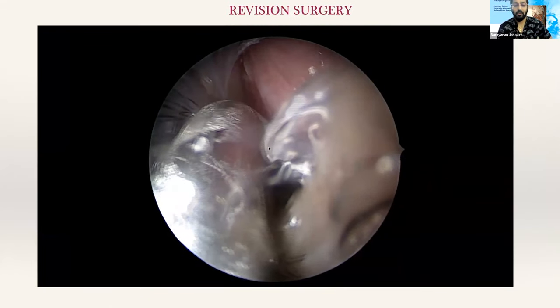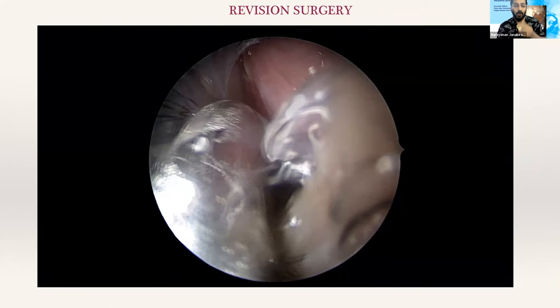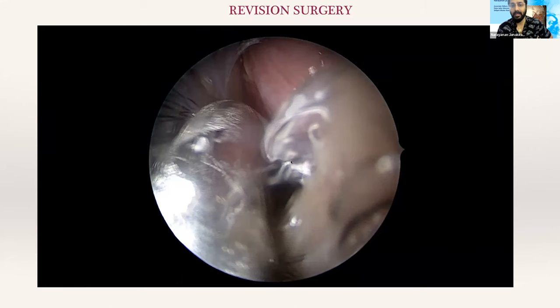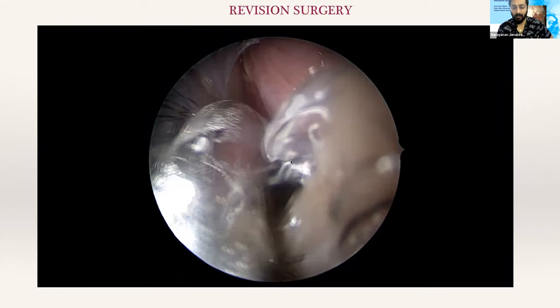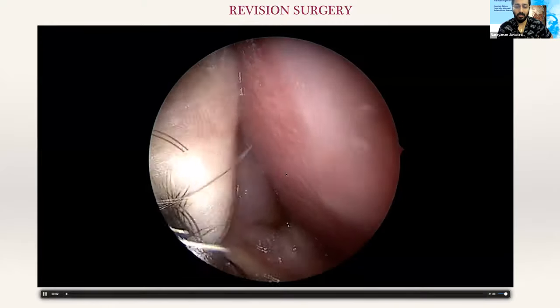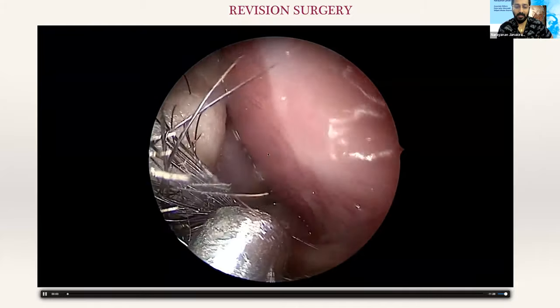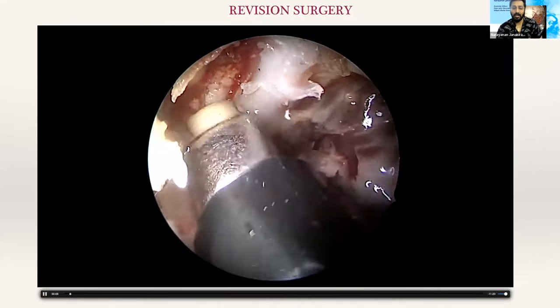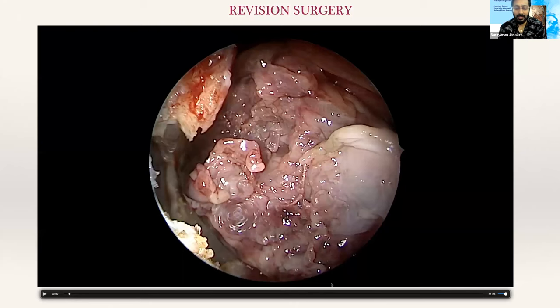Now let us go to the more important part — the surgery. I'm going to correlate it with the scan as I go. The first thing to understand in JNA surgery is that I am trained as a four-handed surgeon. I always like binostral four-handed access to any vascular tumor. You can see the septum deviated to the right, the inferior turbinate, and the mass after decongestion — which shrinks — but this is not looking like a typical JNA.